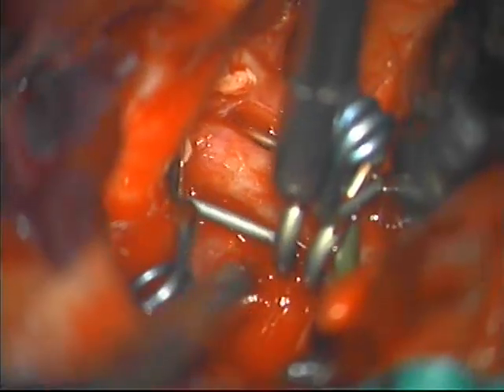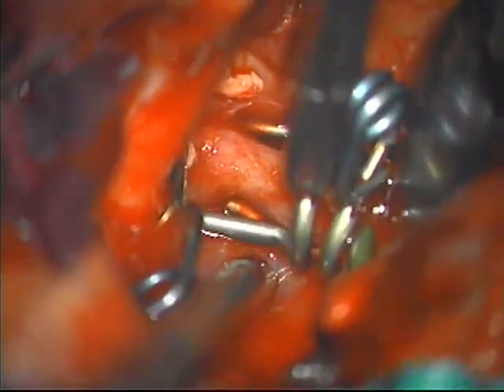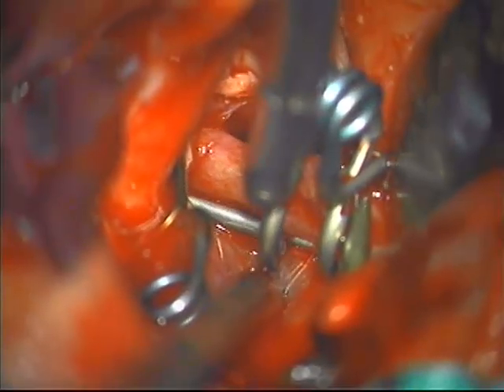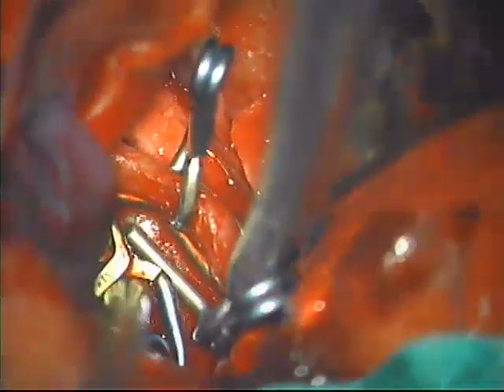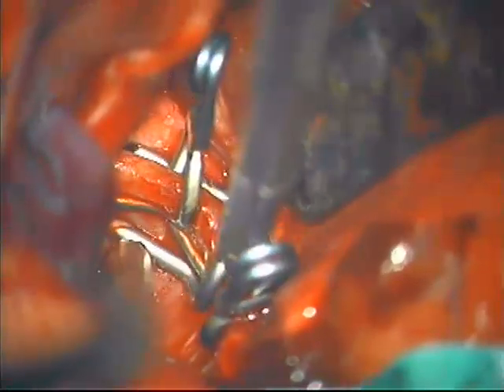A first and a second ring clip are positioned, taking care not to open the aneurysm dome. A third clip is necessary to occlude completely the neck of the aneurysm.